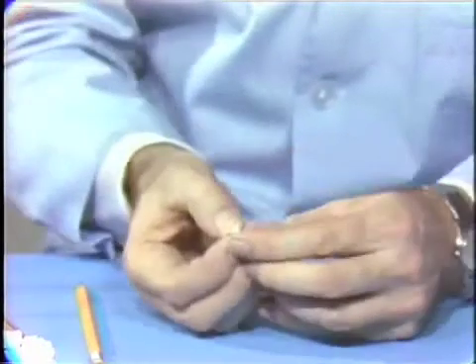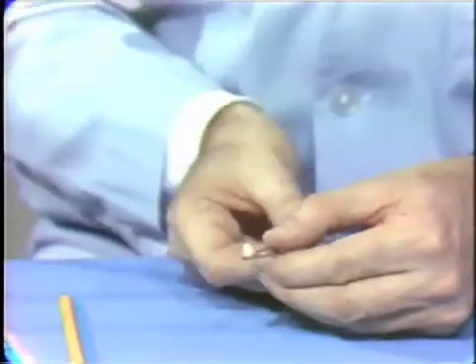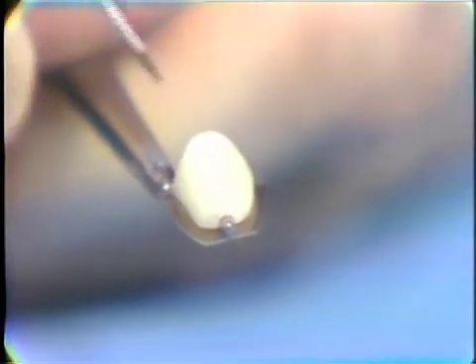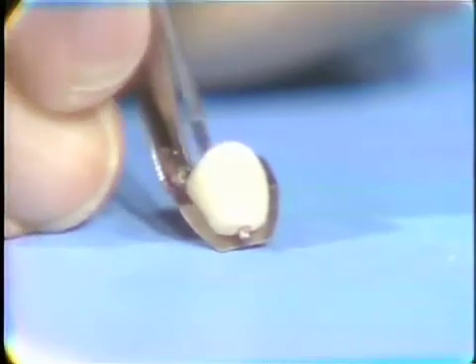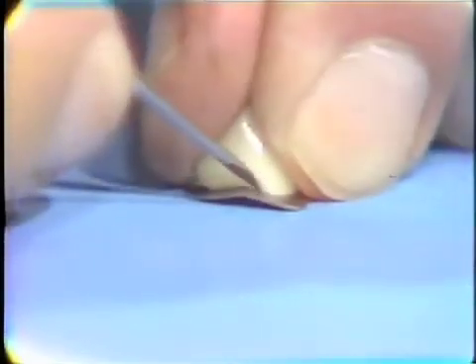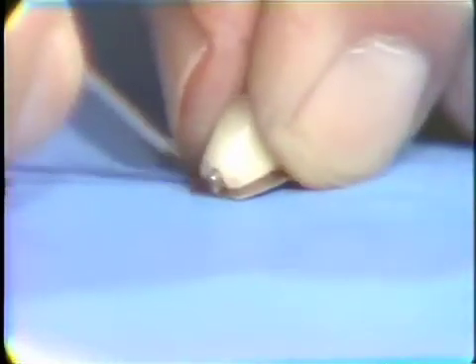So now we put our backing on, and let me see if I hold this in some tweezers, perhaps it'll give you a chance to see it. Here is the backing in position on the facing, and now we're going to take our scriber and mark a point all the way around there to indicate the boundary from the porcelain and the size of backing we want. I still have to get a good grip on this to do it, and it's going to just cover it up, I'm afraid. In the areas where it's beveled, you have to make sure that the pointer you're using is fine enough to go into that bevel and to mark those situations.